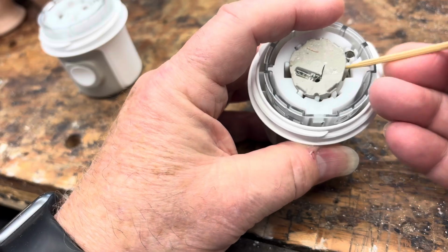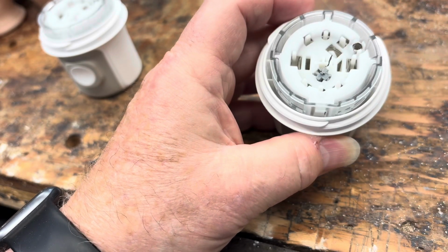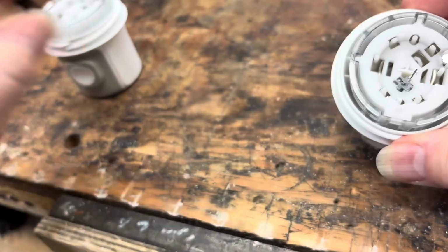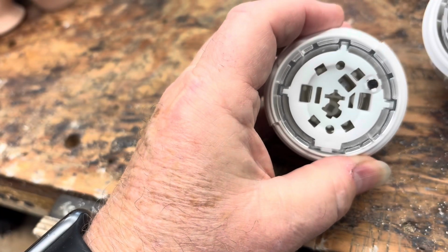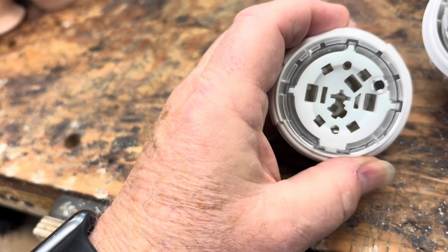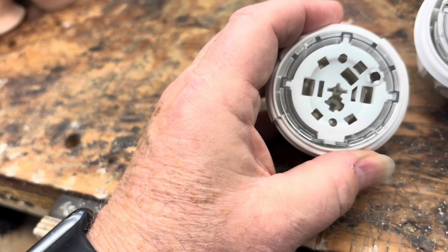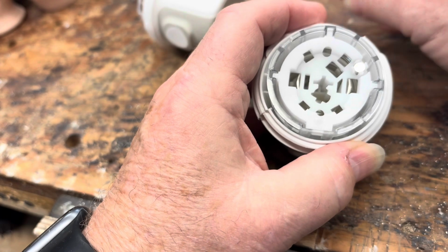Once it's inserted, this isn't there. The needle is there. Normally in a spent one, the needle is retracted. I've removed the needle from this because I lost the battle too many times. Okay, I'll walk you through how to rearm this.